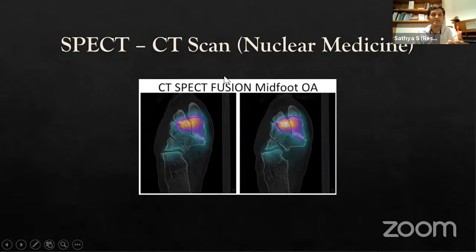Before these scans, we always ensure the person doesn't have any contraindications, like exposure to radiation, pregnancy, children in a lower age category, or having had many CT scans. And you can advise your doctor or general practitioner whether they would benefit from such an investigation to rule out what you're thinking of.